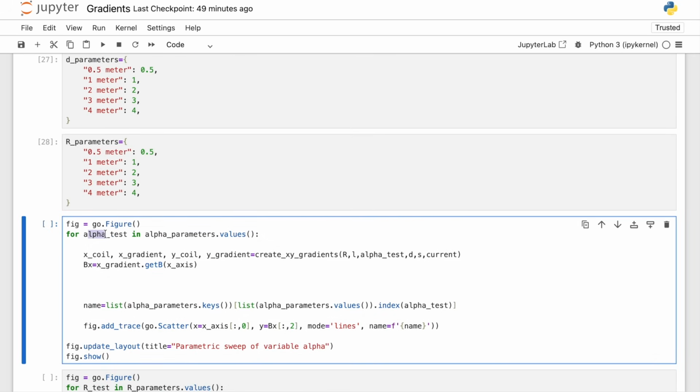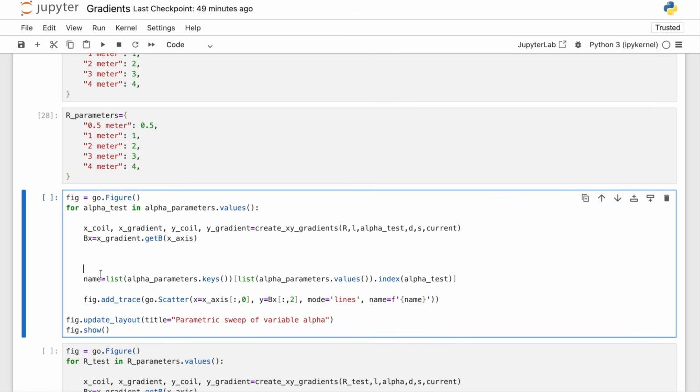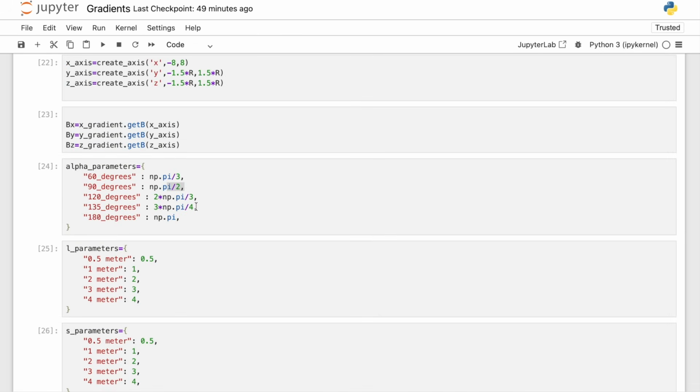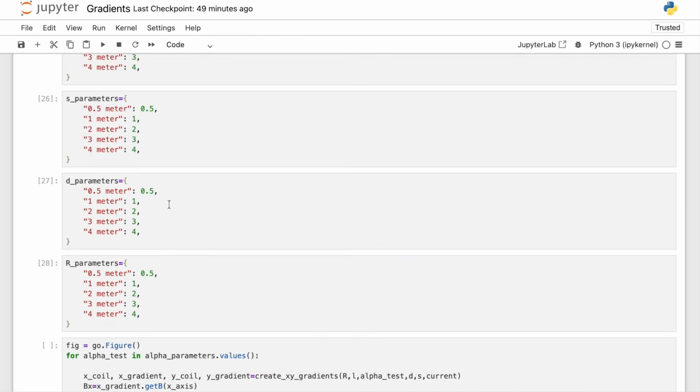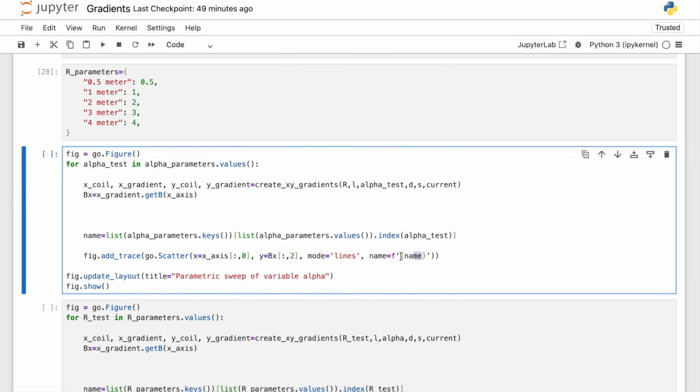That's why I will make sure that I am inputting my alpha test, and I will calculate my bx gradient. Similarly, this can be done for y and z, but here I'm just doing it for x. And the name, which is the legend in the graph, would be just the corresponding value of alpha test from the dictionary in alpha parameters. So let's say if the alpha test is 3 pi over 4, the name would be 135 degrees. And then for each iteration, I will add a line, and the name would be this.